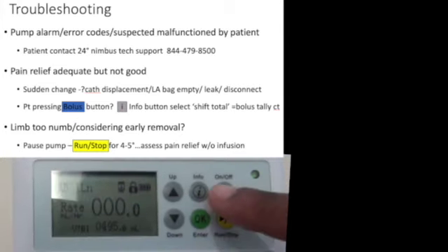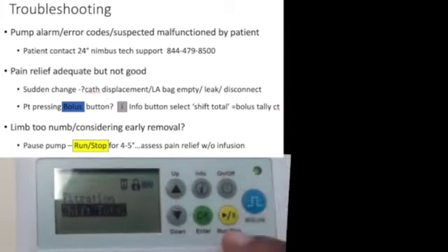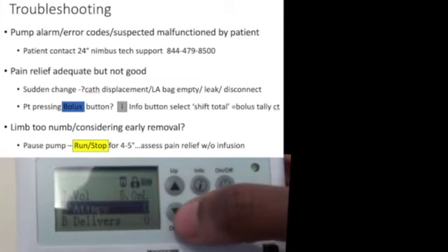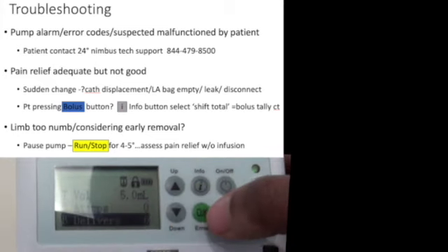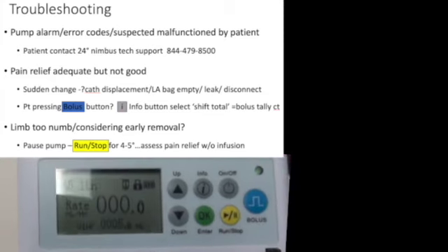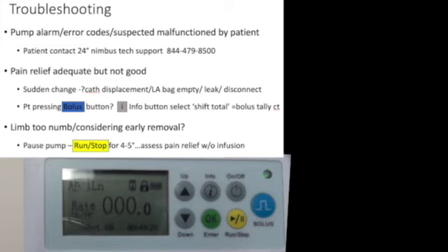When the infusion is running, shown by the green light, you can press the info button and navigate to 'shift total' — toggle down, press OK to select. This shows how much the pump has delivered: for example, 5 mls delivered, with no demand boluses attempted or delivered. Use the back button to return. This information helps determine whether the patient is using the pump and understand the type and pattern of the patient's pain.